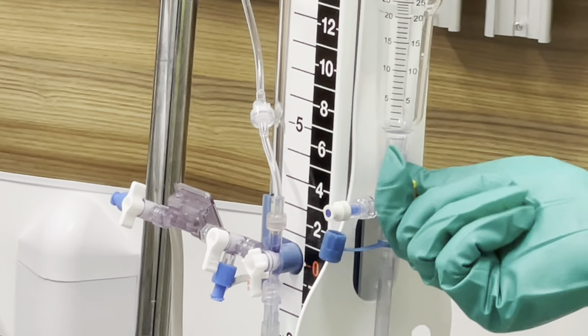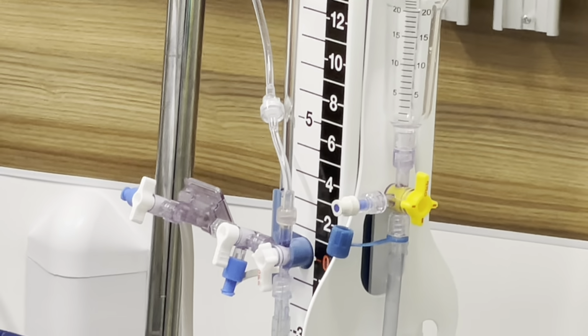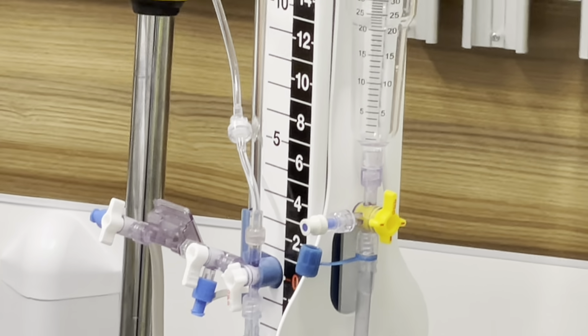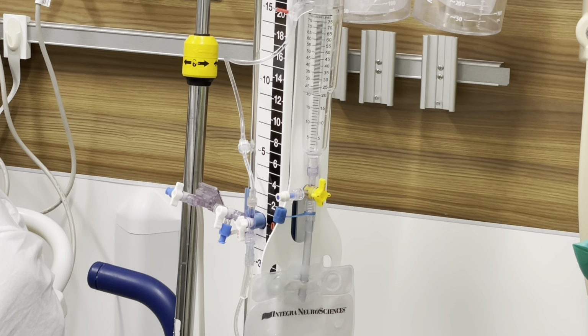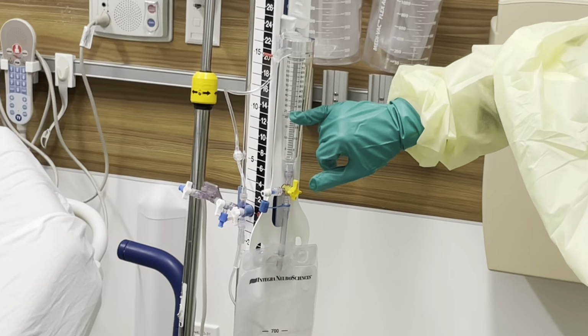And then you're going to flip it back up. It's very important that you make sure that this is closed and that you're only emptying it every hour. If you leave it open, you don't know how much CSF you're draining. CSF drainage is going to be different for everyone depending on their mechanism of injury. I would say that you have this little chamber here that goes between 20 and 25.